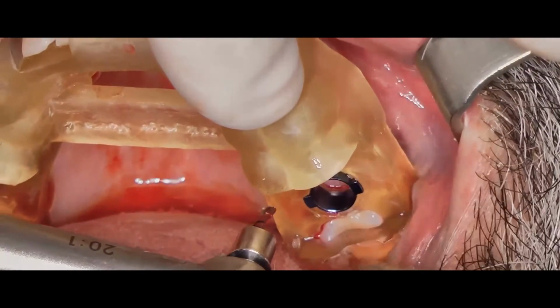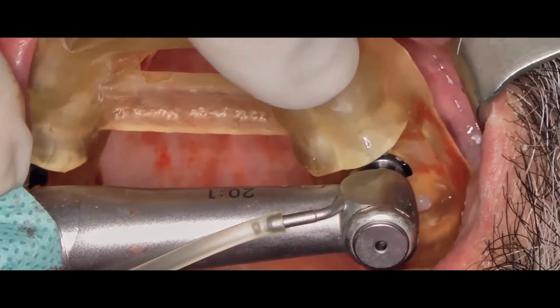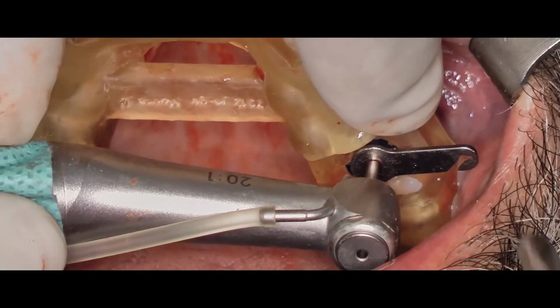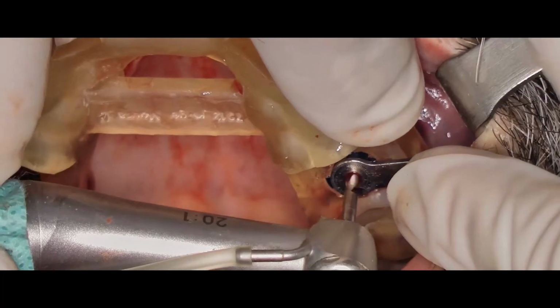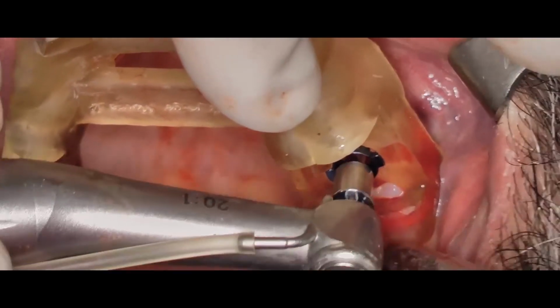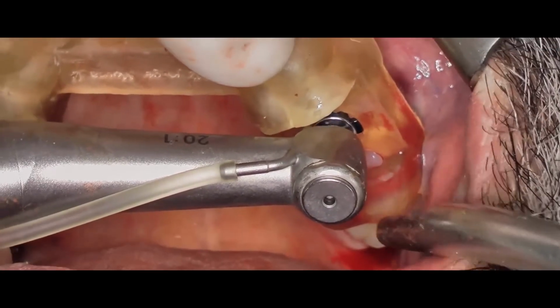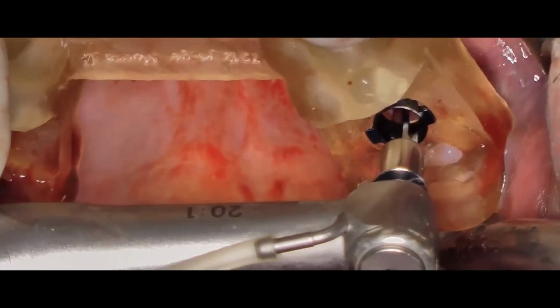Despite being apparently easy, case selection for your first case is of particular importance. Many times, clinicians that have limited experience with guide systems ask advice for complex cases and propose the use of a guide, hoping that the use of this technology can transform a challenging case into an approachable one.